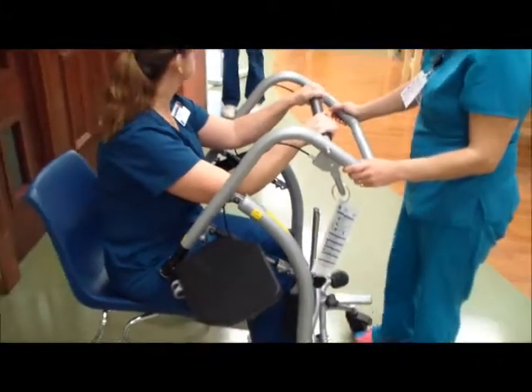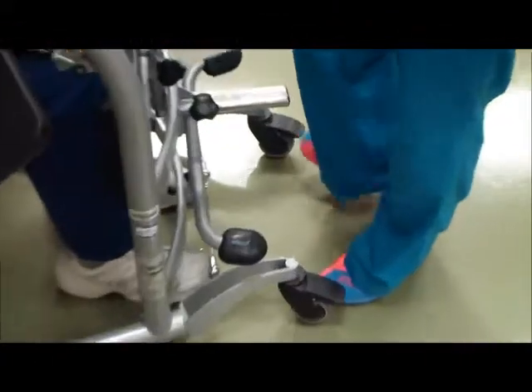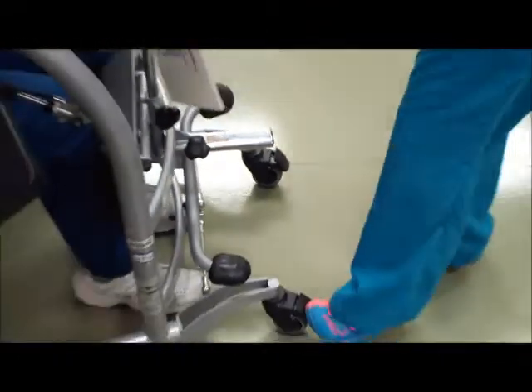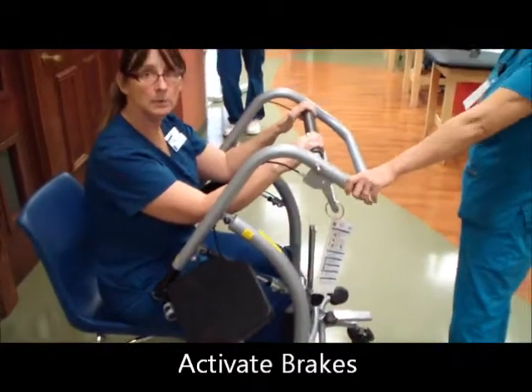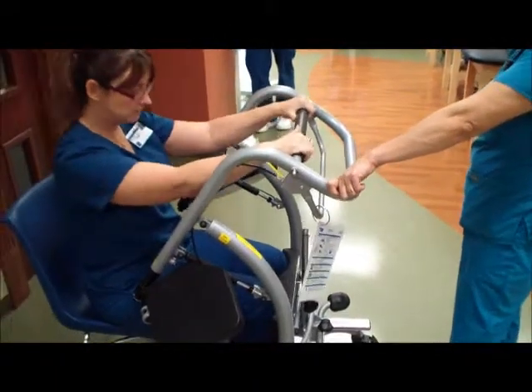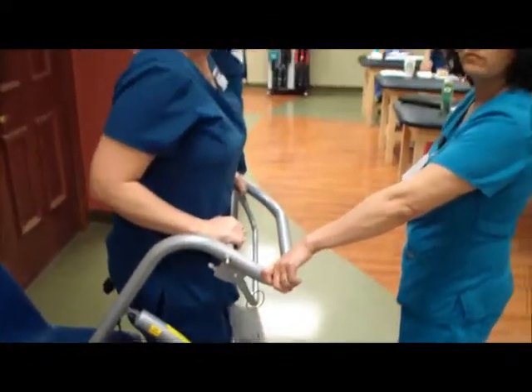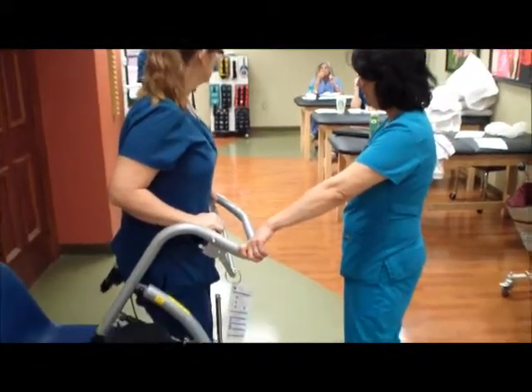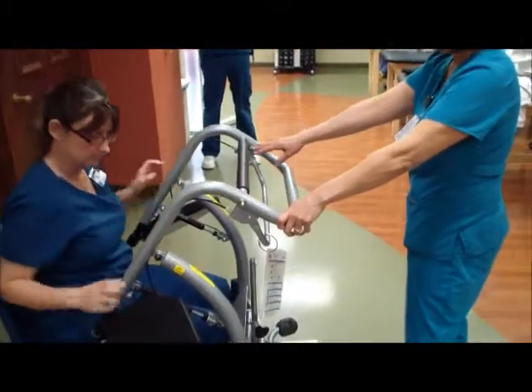So for me to start to stand up on this one, we're going to hit the brakes. On the lift ones, we don't use the brakes because it needs to adjust for the weight with the sling. But on this one, since they're going to pull on it, we want to hit the brakes. All I'm going to do here is counter pressure, and I should be able to bring myself up. You can still practice like you normally would with a walker, one hand on the chair, one hand up here.